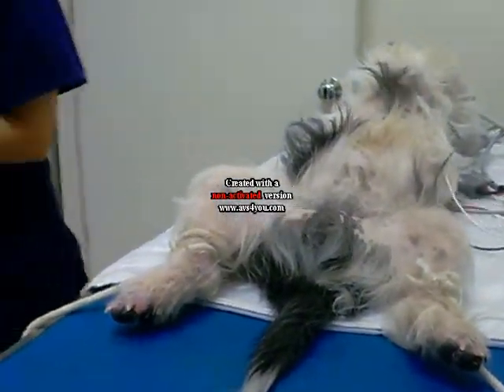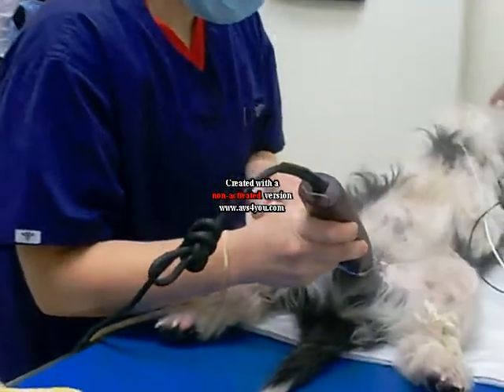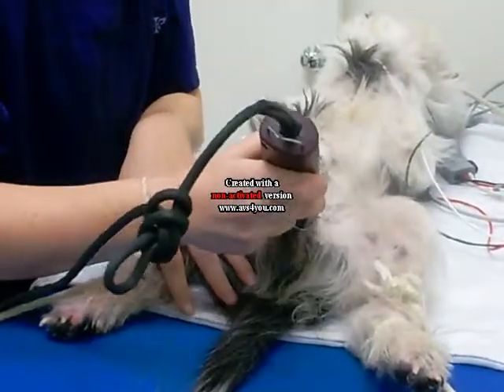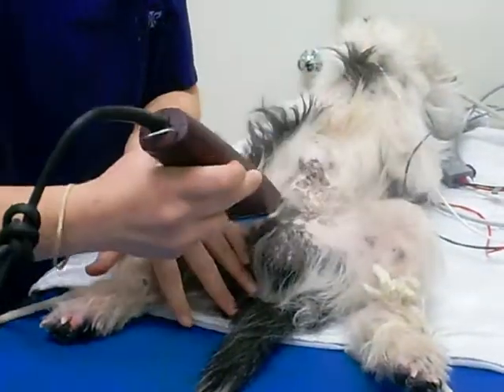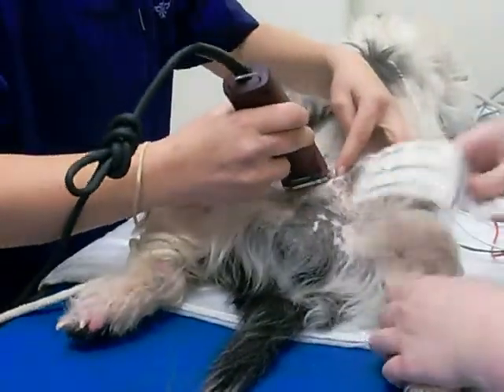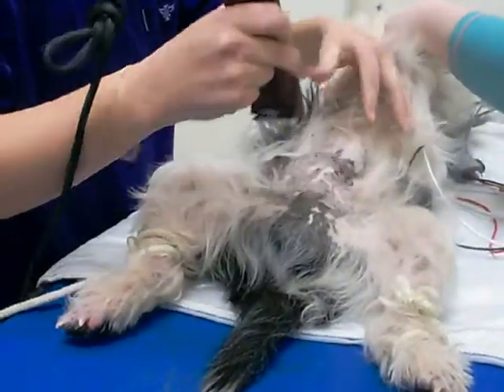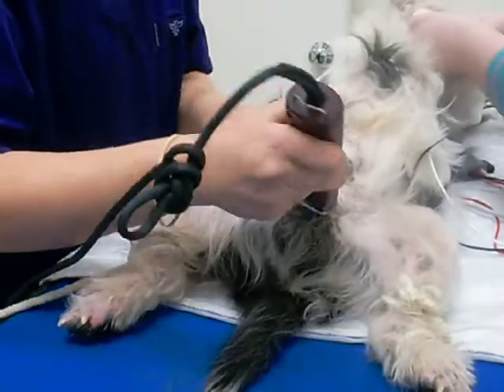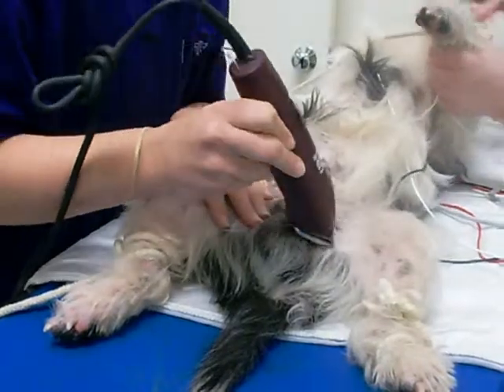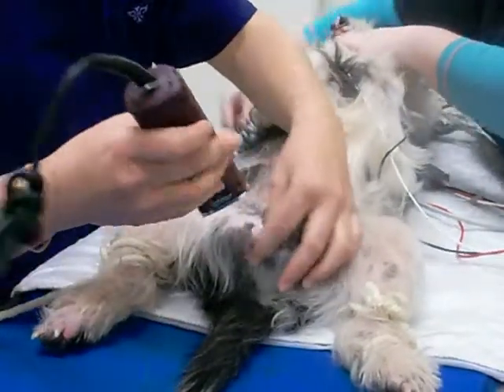You'll see I'm also shaving his right hind dorsal for removal of an adenoma. Then the owner, who is our receptionist, also decided she wanted the one on his left front also removed. But that was when the surgery had already started. So the last part of the surgery, we will also shave the left front after the neuter and removal of the one on the dorsal right hind has been taken off.